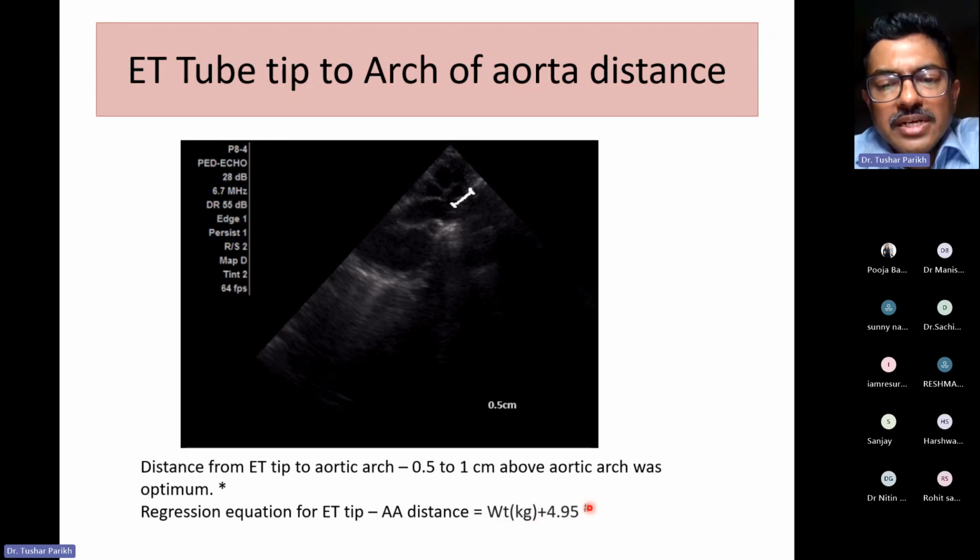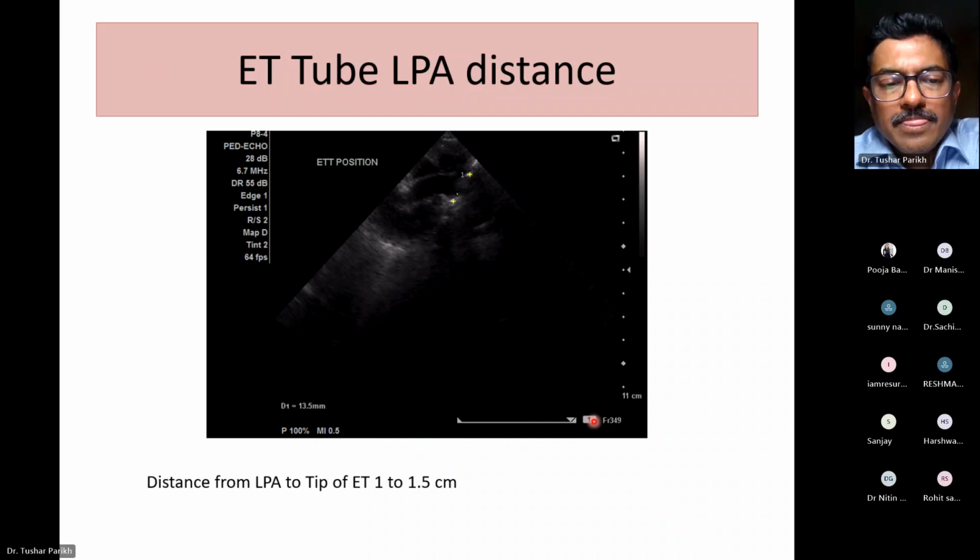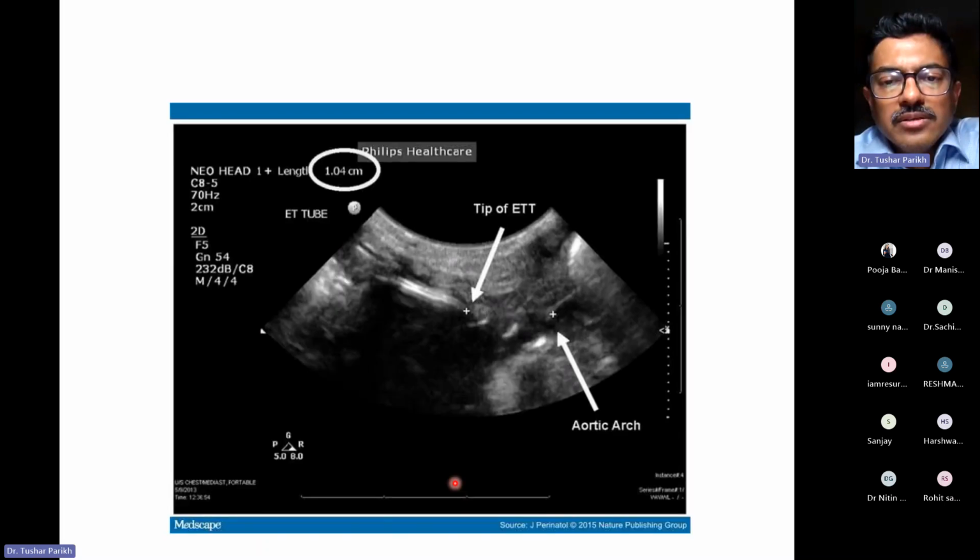But this is a recent study which Anup and Gangaram team have done, published in Indian Pediatrics, and they have shown that this is a regression equation. So basically, one can see, but basically you have to see the tip of endotracheal tube and upper border of arch of aorta, and then this distance should be 0.5 to 1 centimeter. From the LPA, it is 1 to 1.5 centimeters, a little higher, half centimeter higher.